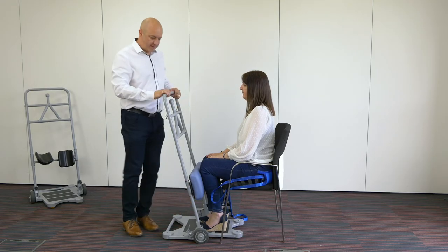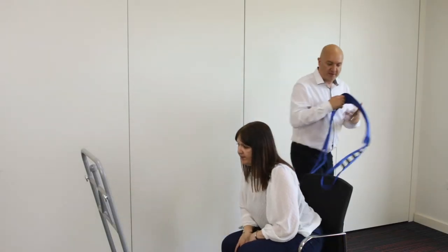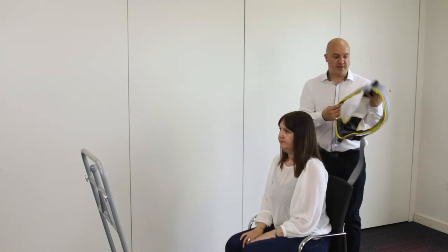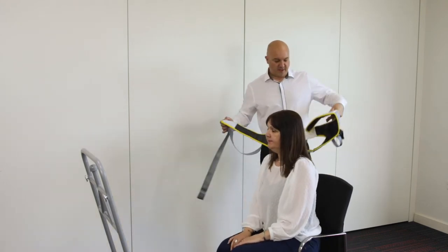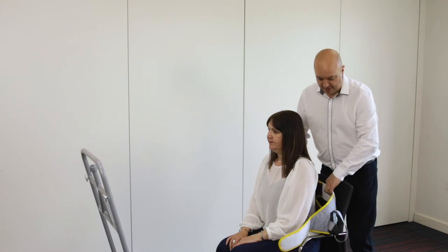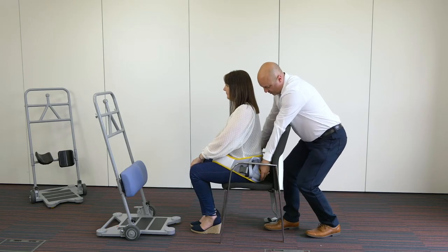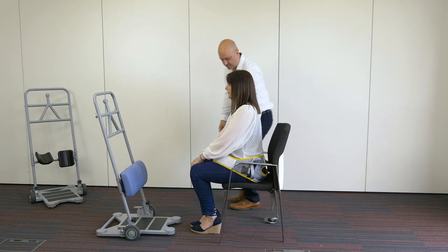I'm going to move the unit out of the way and run through this once more. This time we're going to use the safety belt. Sarah, if I can ask you to shuffle slightly further forward. This belt fits around Sarah and is designed to support her once she has stood up — so she's going to stand herself up, and I'll then support her with the belt to carry out the transfer. Down to the base, tuck slightly around at the bottom, and fasten the velcro around the hips.